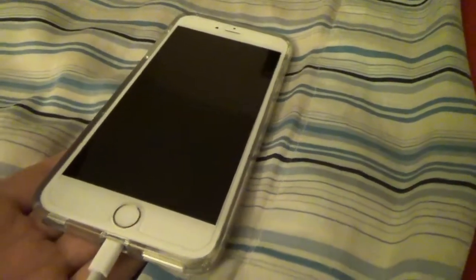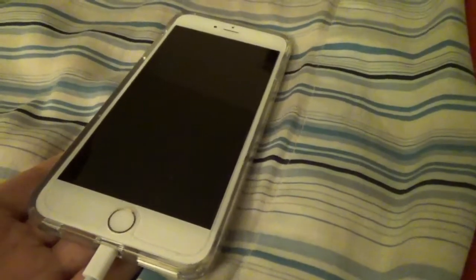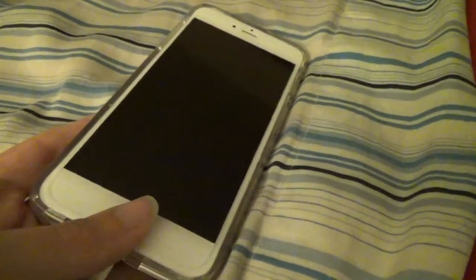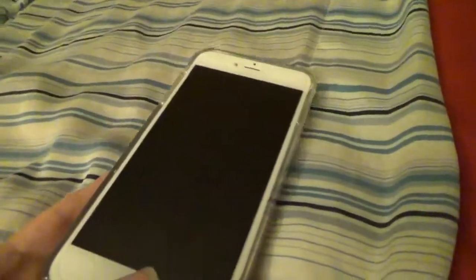Whereas the really cool thing about this is that if you want to save an image, you can save however many you want to the iPhone's photo gallery. And of course you get all the benefits of the iPhone for honestly a bit less, and it's a lot more portable than a typical video magnifier.